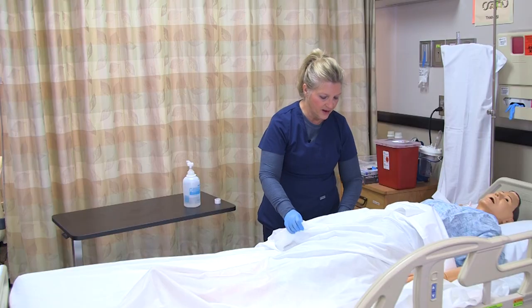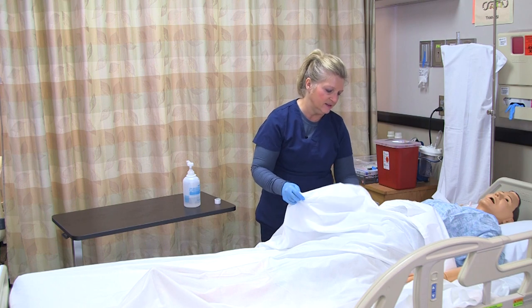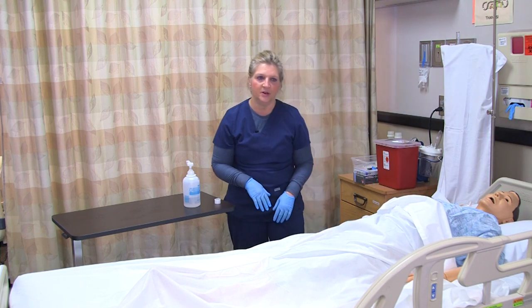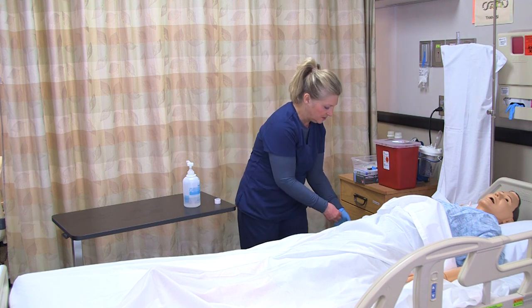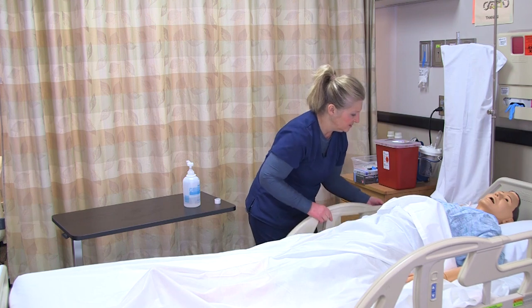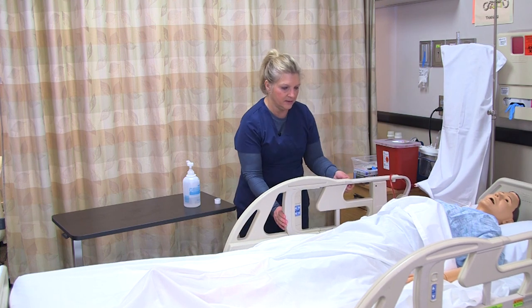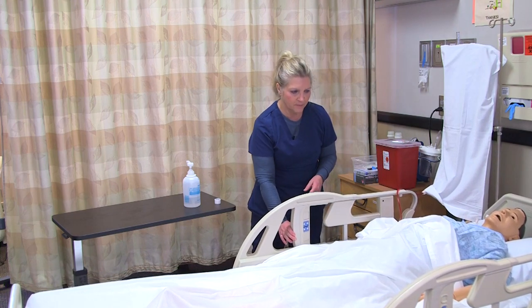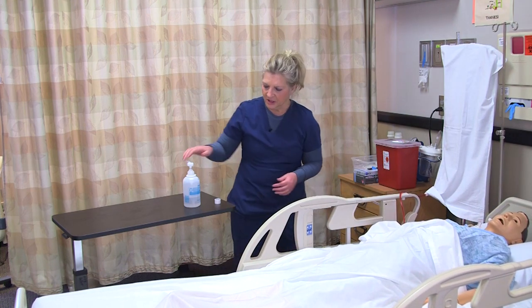I tell the patient to keep an eye on the site — if they notice anything wet or draining, to make sure they notify me. Then I remove my gloves, put the side rail up, lower the bed, make sure the patient is comfortable, and wash my hands.